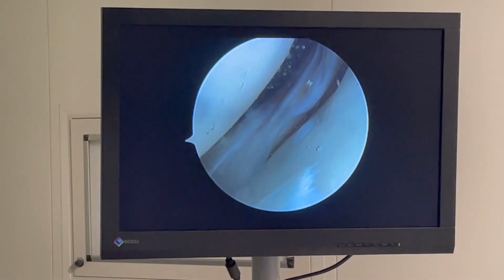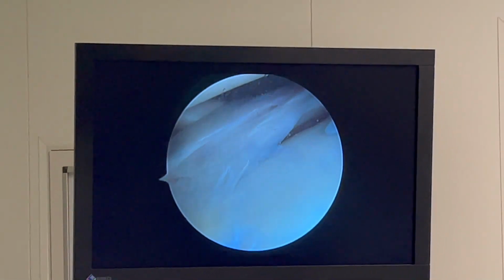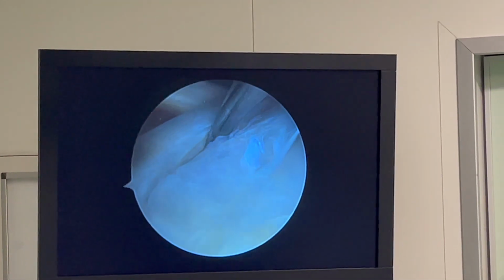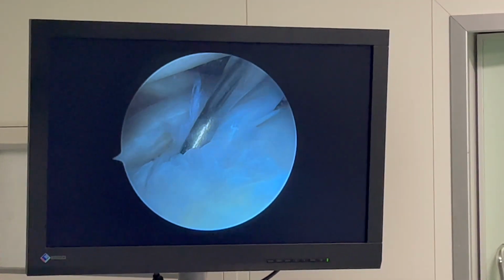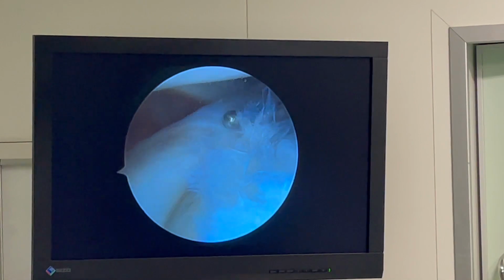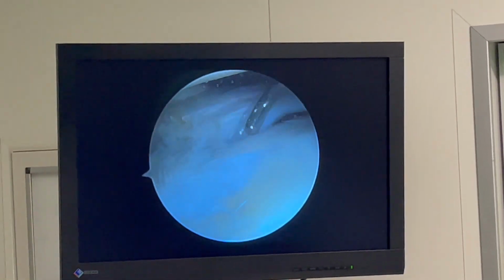Yeah, there's a small tear, right? You can see, no? Yeah. So it is not normal. It's in a very inside part. It's not going across. Yeah, it is, which we can take it off. We don't have to suture this one. Yeah, the peripheral part is intact, right? This part is intact, it's good. Only the inner part is broken, which has no blood supply at all, this part, right?